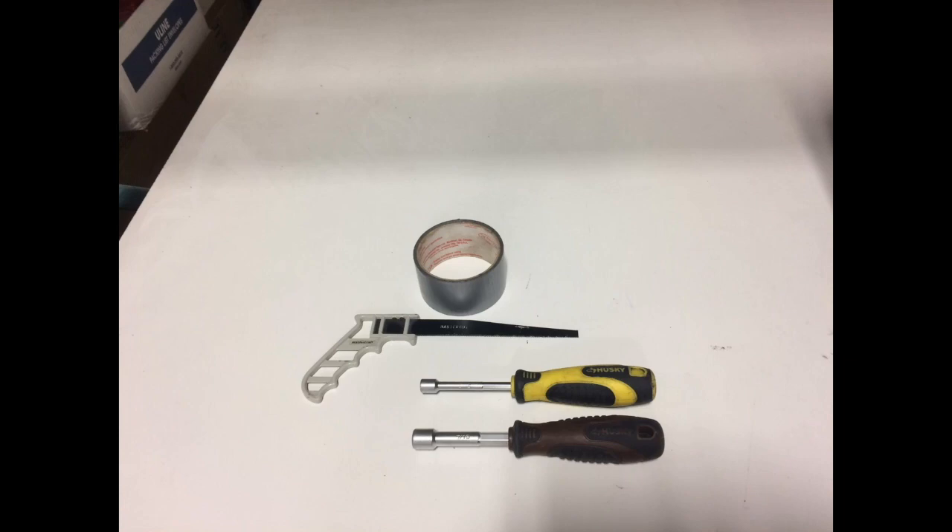The following tools are required: 5/16th nut driver, 7/16th nut driver, pipe saw, and duct tape.